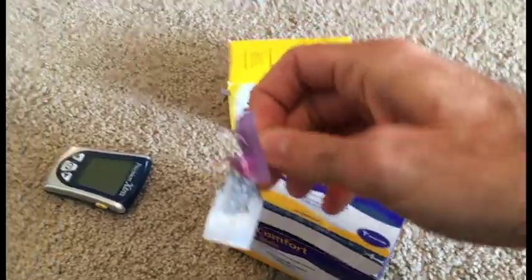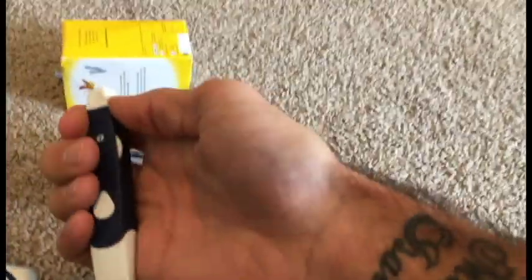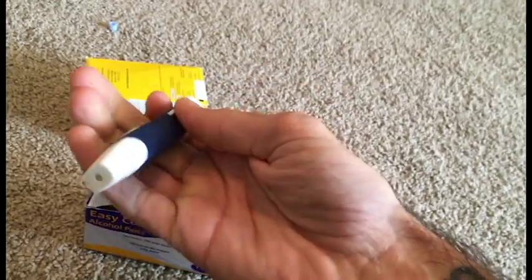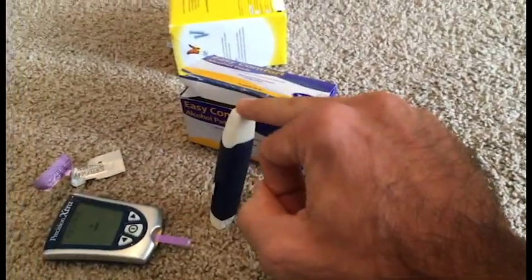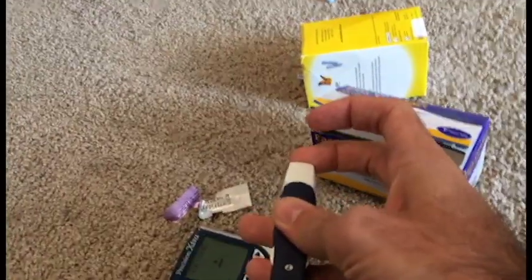We're missing one thing — the ketone strip. I've already opened it and cleaned my finger with alcohol, so my finger's good to go. We just insert the tip of the strip into the machine, which turns it on, and then you pull that up to load the spring. I'm going to position it so you can see — ready, set.